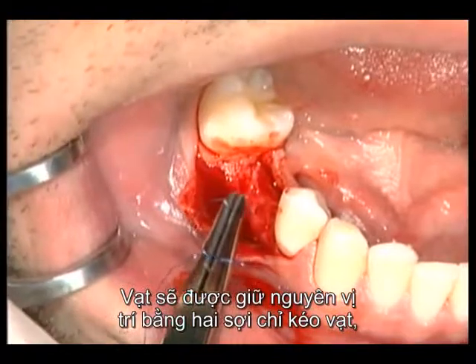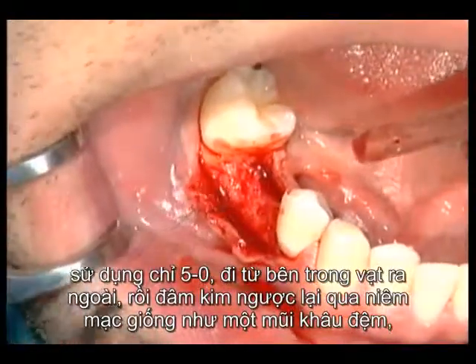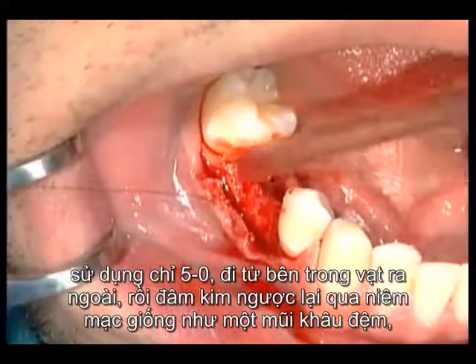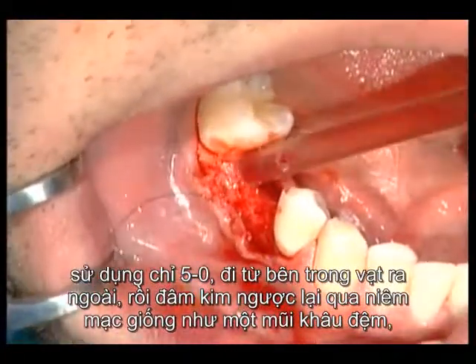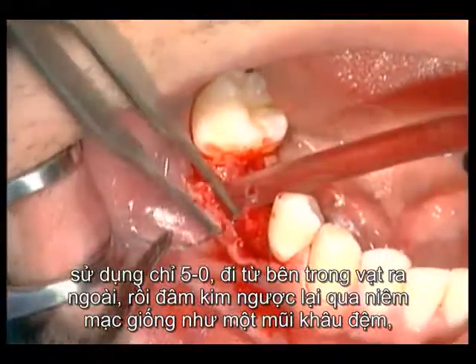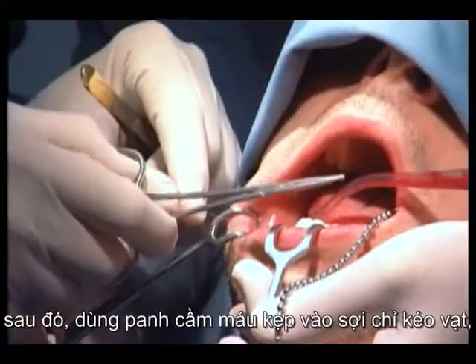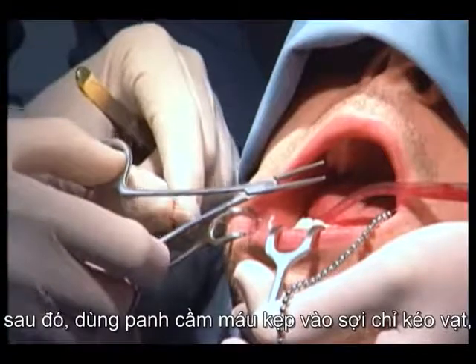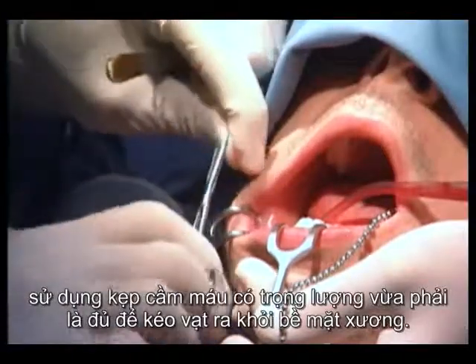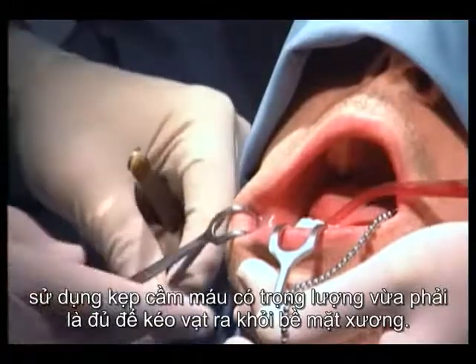The flaps will be held in position with 2 retraction sutures. The fine 5/0 suture is applied from the inside of the flap, going back through the mucosa like a mattress suture. Then the suture is attached to a hemostat. The moderate weight of the instrument is sufficient to keep the flap away from the bone surface.